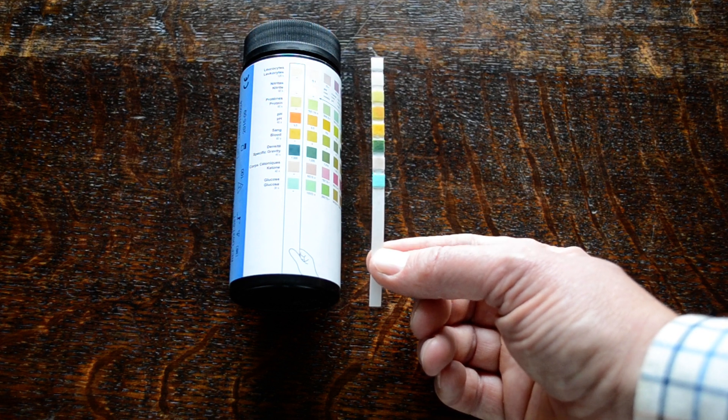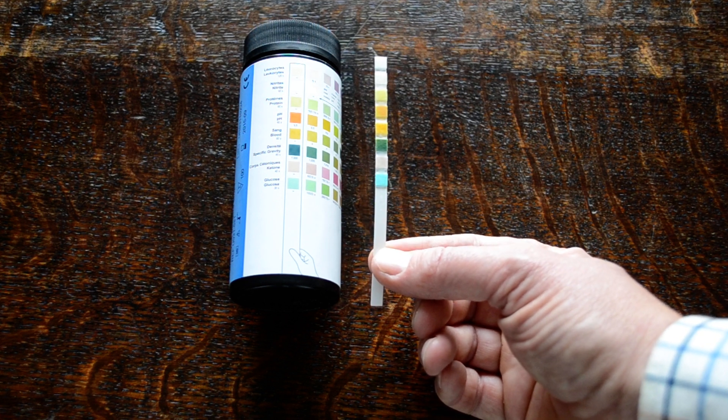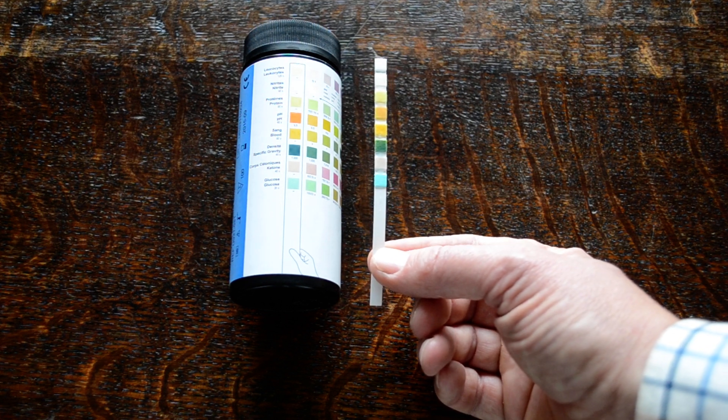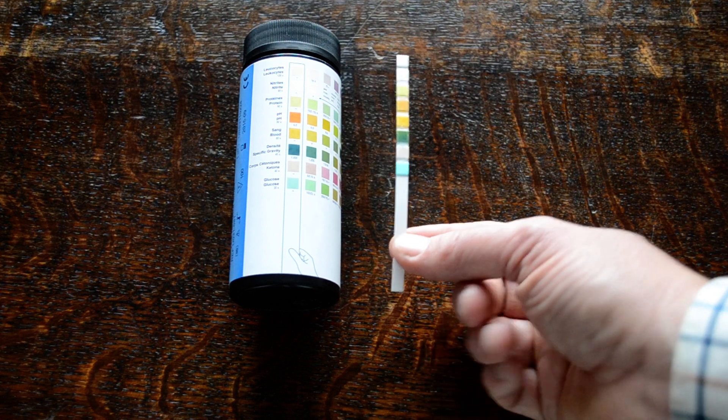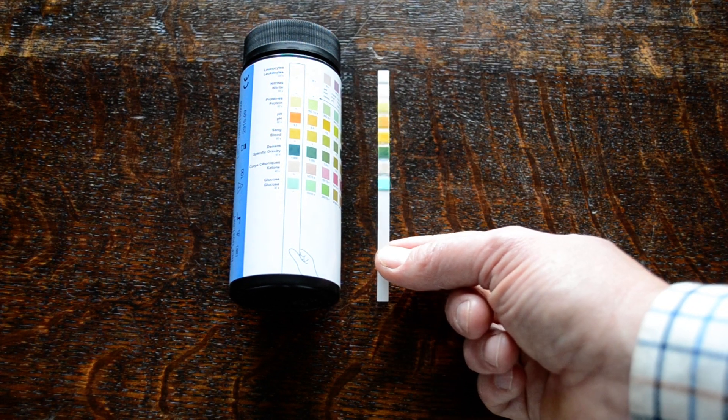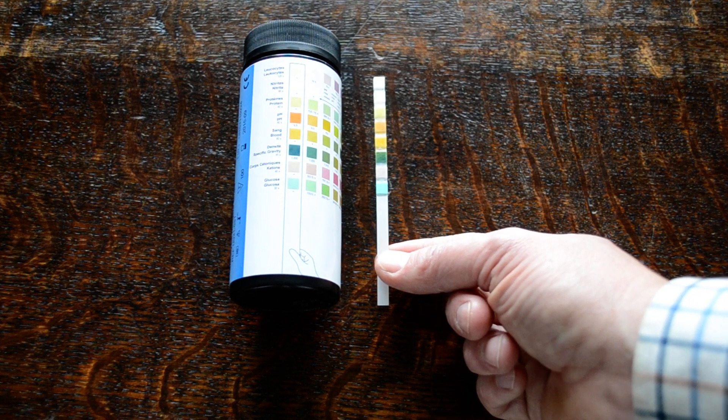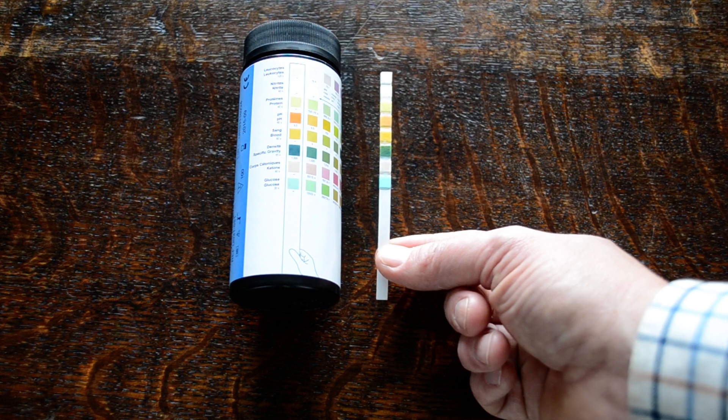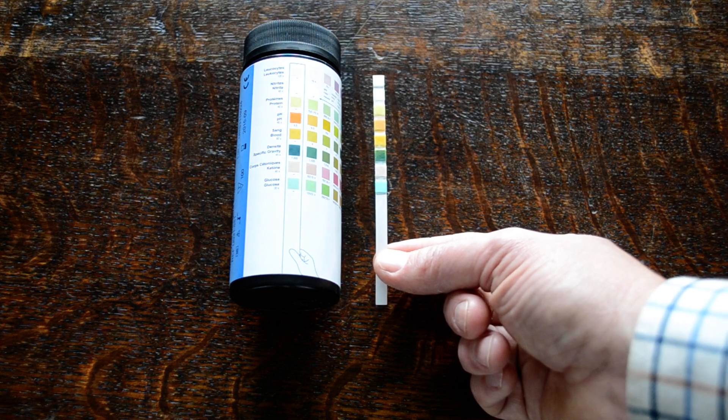Tap it gently to remove any excess urine. If you've got a bit of tissue or something you want to put this onto, that's a good idea because it will absorb any excess fluid and stop any leaching between the pads.